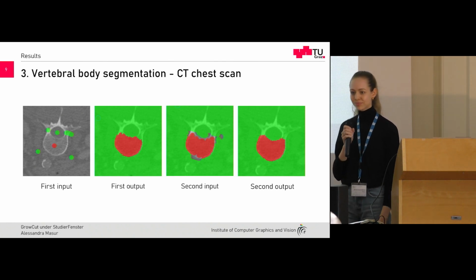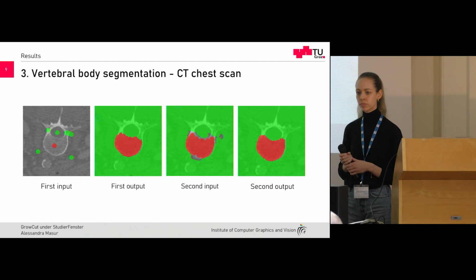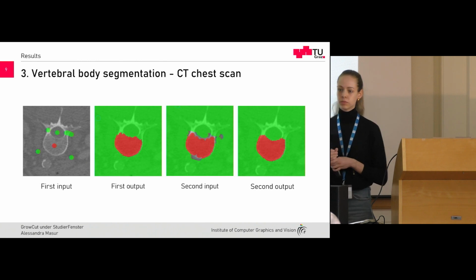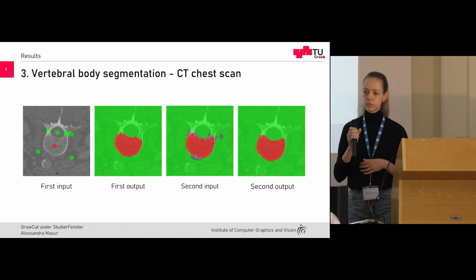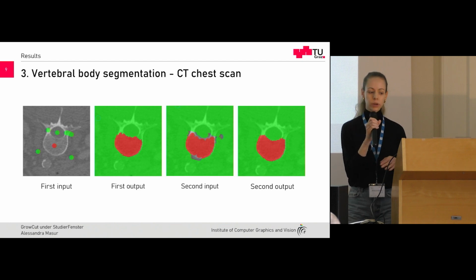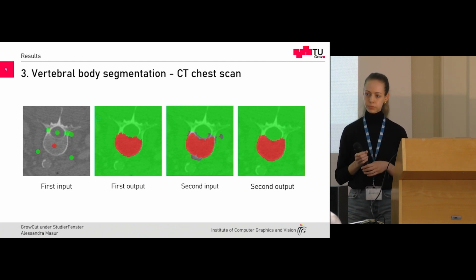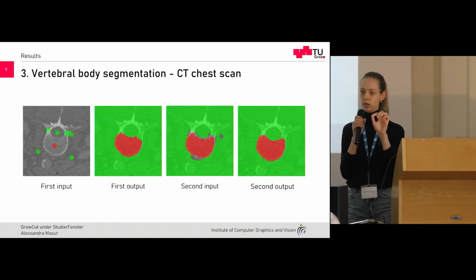Did you think of adding undo functionality to the brushing? You know, like for instance, you click on the top and then you reset the whole thing. Maybe it would be cool if you have undo functionality. Oh, yes, I showed it quickly. We have an eraser brush where you can erase it. Do you mean that? Practically, if you do brushing and you have undo, it's much quicker, right? You don't have to go and erase it, or reset your last step or something. Exactly, yeah. That's a good point, actually. We didn't think about it, to be honest, but this would be easy to implement.